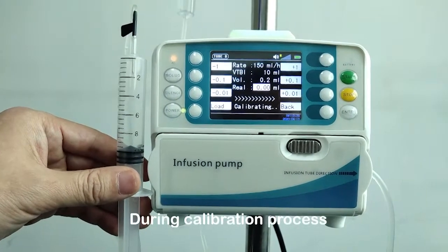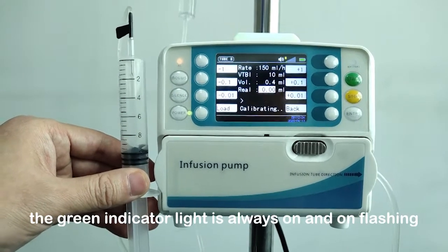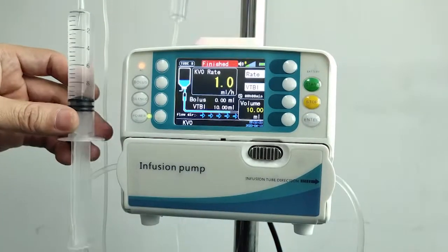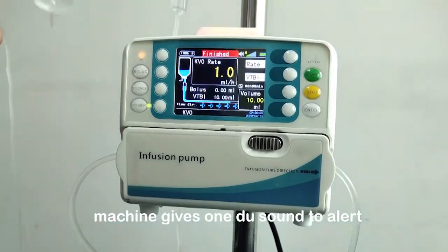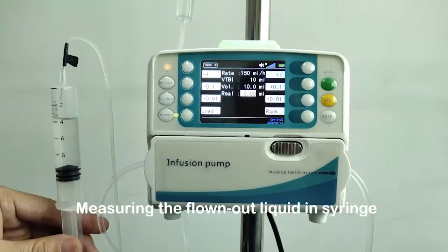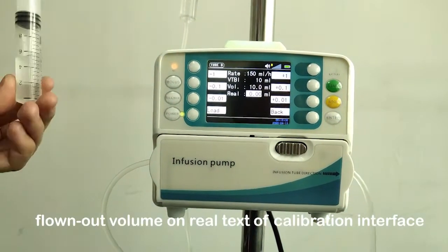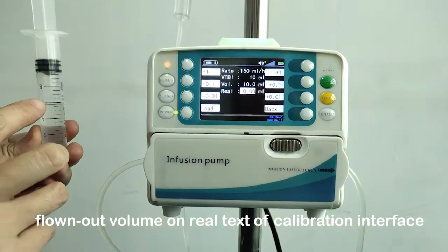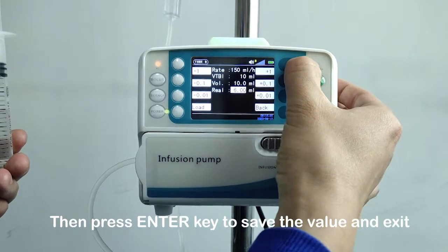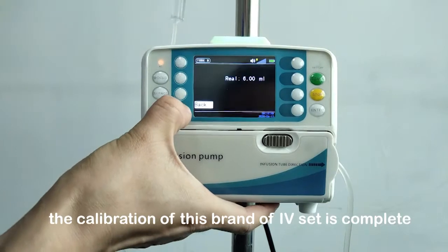During the calibration process, the green indicator light is always on and not flashing. After 10 milliliters finish infusing, the machine gives one beep sound to alert. Measure the liquid that has flowed out into the syringe or measuring cup, then input this actual flowed-out volume into the real value field of the calibration interface.